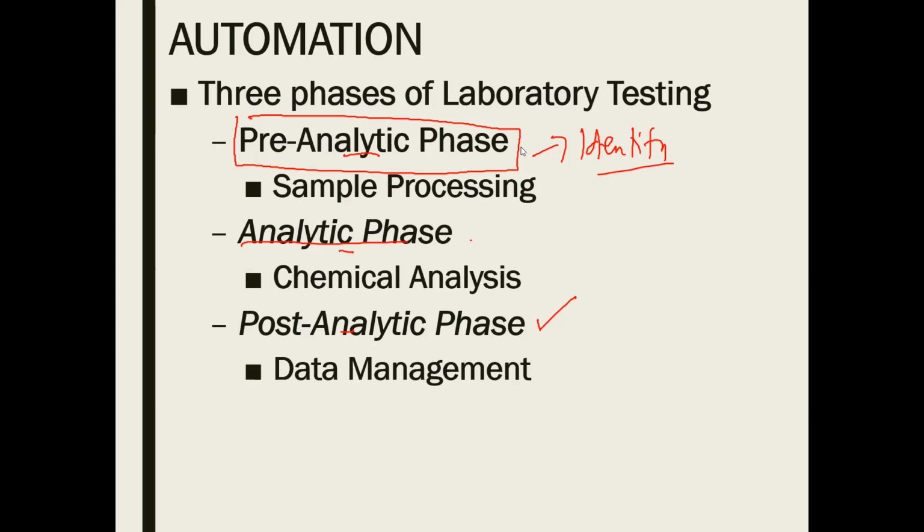Well, the heart of analysis is your analytical phase. This is your chemical analysis. In chemical analysis, this is the time wherein your laboratory analyzer or your automated analyzer will do the testing. And lastly, the post-analytical phase wherein you are going to have your data, the results. Okay? Wherein you will have your results.